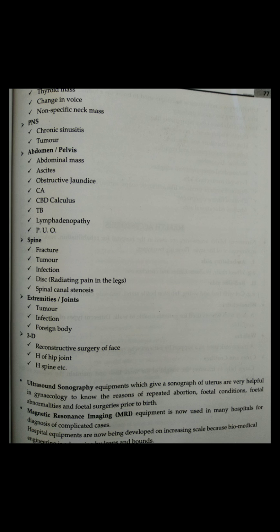Now I will start the next point, ultrasound sonography. Ultrasound sonography equipments, which give a sonograph of the uterus, are very helpful in gynecology to know the reasons of repeated abortion, then fetal conditions, fetal abnormalities and fetal surgery prior to birth.